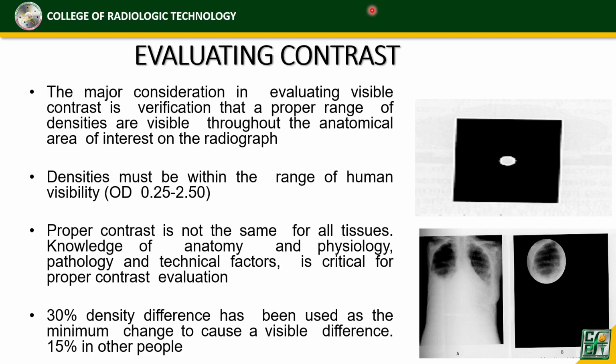Or kung hindi man pathology, yung mga treatment na involved such as cast, diba? Cast or, ano pa, yung mga implants. Siyempre kapag in-explain natin yon, so we must use a little higher than the routine. Okay?